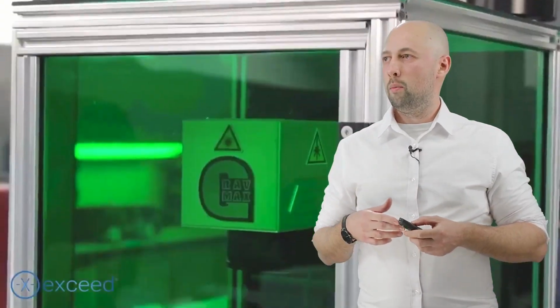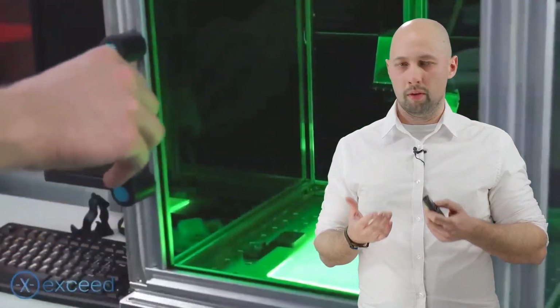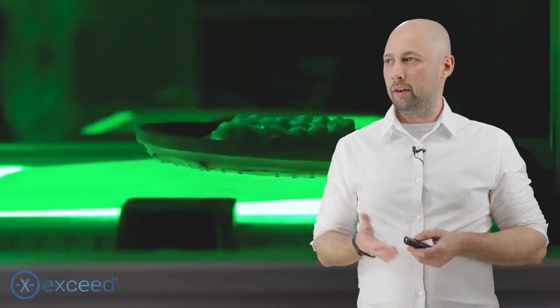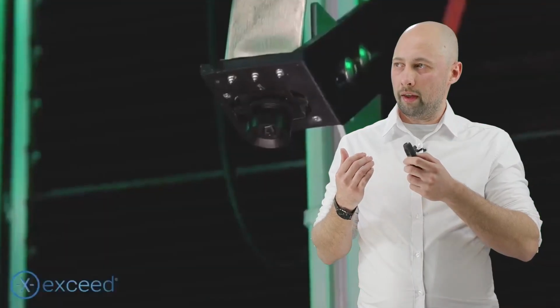This is the system that we have to brand your aligners, to put the logos on the aligners, using the data matrix that is printed with the model, and quite simple equipment like the camera and the laser scanning the data from the data matrix can put actually the step number.